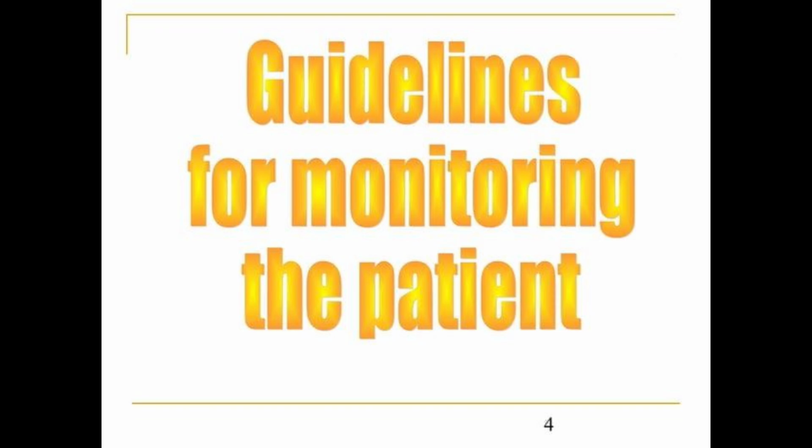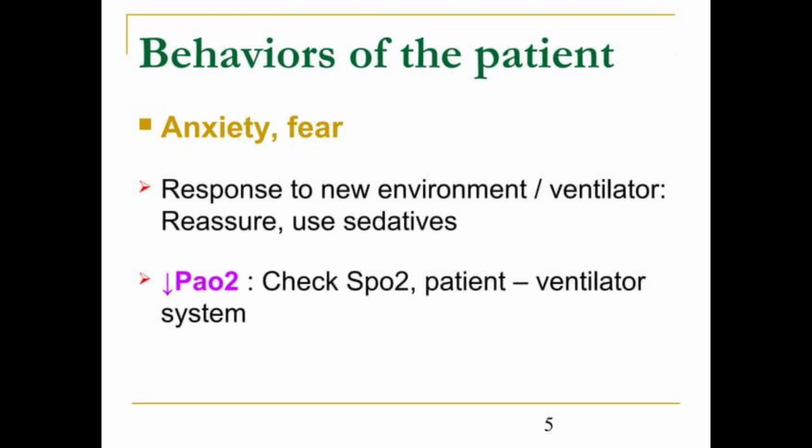When acquiring the data, we don't just look at isolated electrical numbers, we constantly correlate sensor waveforms with the actual physical behaviors of the patient. In observing the behaviors of the patient, the first major behavioral state is anxiety and fear. Patients often experience a high level of stress as a direct response to the hyper-connected, noisy ICU environment. When the patient is fighting against a ventilator, we coordinate the use of appropriate sedation to calm them.